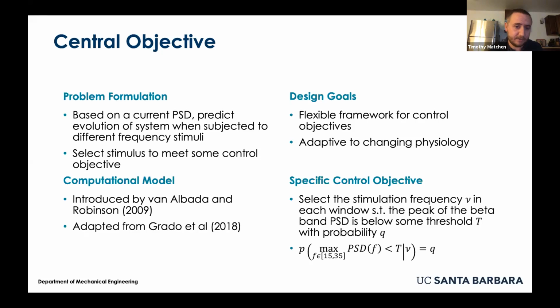So this became essentially a regression problem. And I want to note here also that we're still using our same autoencoder. So we trained this autoencoder on the real data. We're going to use that same exact autoencoder, and we're not looking at the full power spectral density here. We're passing that power spectral density through our encoder to get those extracted features, and it's those extracted features that we're actually going to use to make our ultimate predictions.